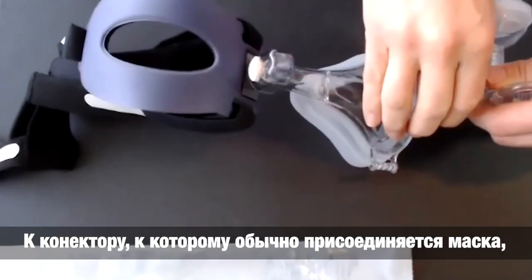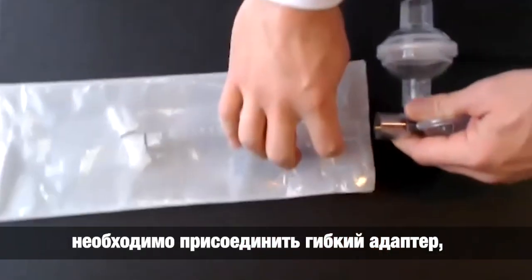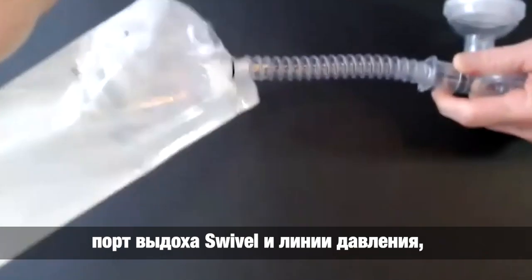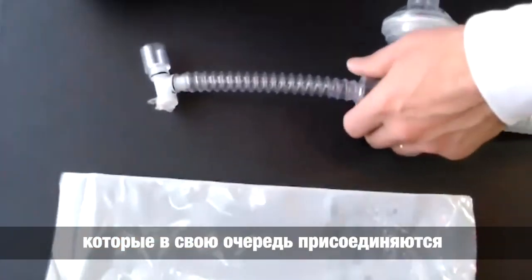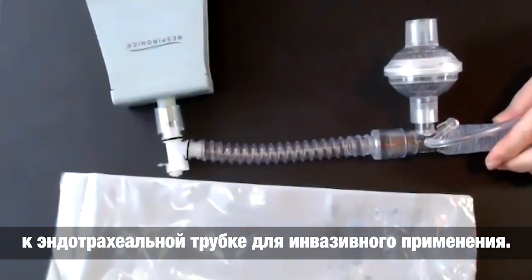For the connection, where the mask normally connects, you'll need to connect a flexible trach adapter, a swivel, an inline suction, and then that will connect to your ET Tube for your invasive application.